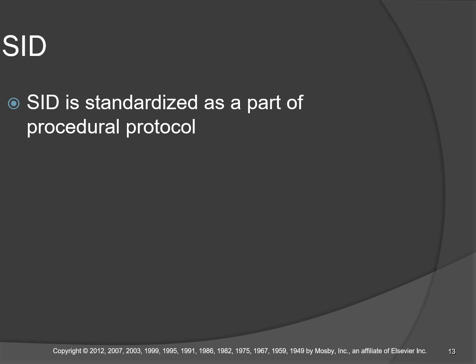Shorter SIDs are going to magnify the middle of the anatomy. Whatever you're actually aiming at is going to be magnified in the middle of the image receptor, and everything on the periphery is going to be spread further to the periphery. So I'll give you an example of what I mean. I don't know if we have a phantom.